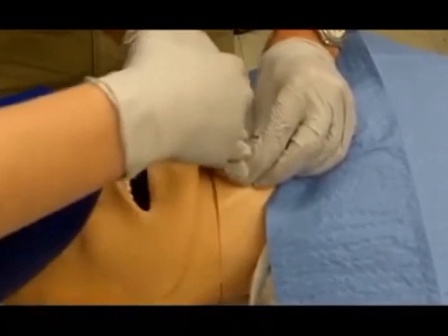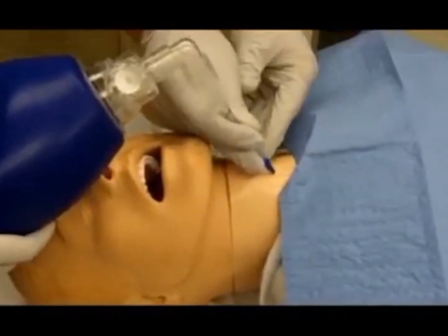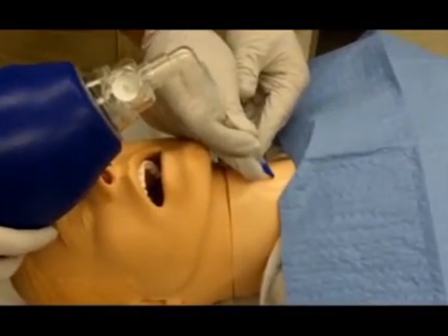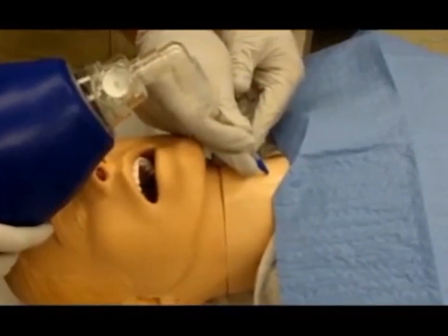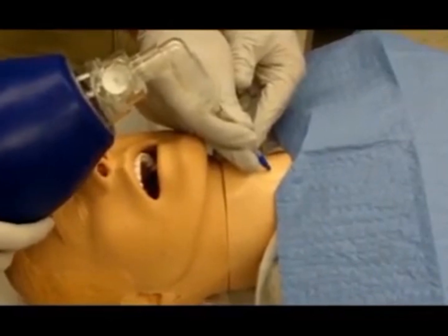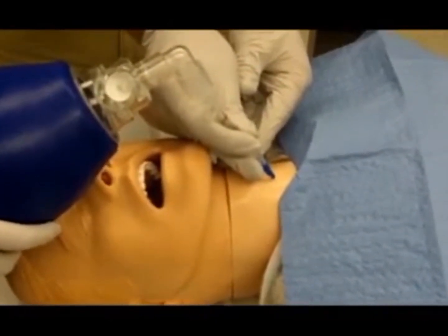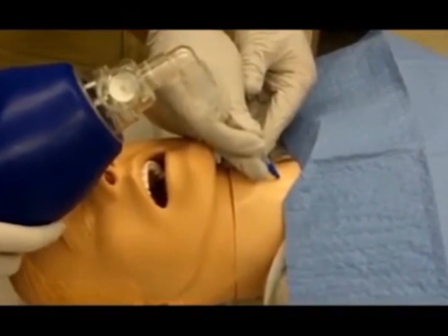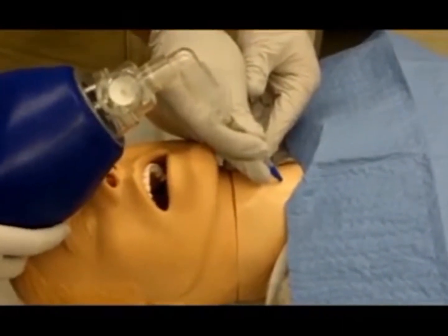Connect the resuscitation bag and attempt ventilation. Note that there will be significant resistance with insufflation. Apply the lowest effective pressure to safely deliver tidal volume with an inspiratory to expiratory ratio of 1 to 3 or 1 to 4 seconds.